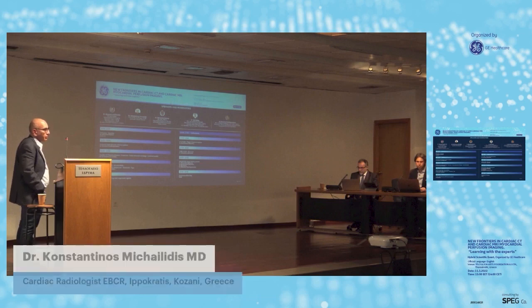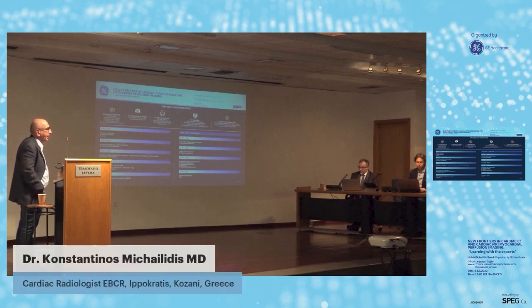This is my favorite report to give, because I'm happy to give it to somebody. It's good to know if he is CAD-RADS 1V, but there is no other technique that can detect a CAD-RADS 1V. Meaning that even with an interventional angio, if the stenosis is 10%, it is very easily not detected because of the nature of the imaging. And we know now from the previous talk that these plaques make the prognosis for these patients really bad.